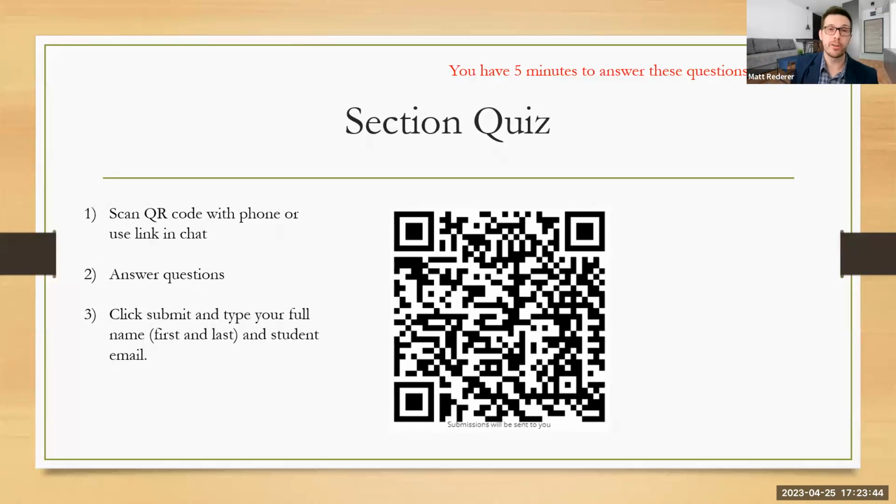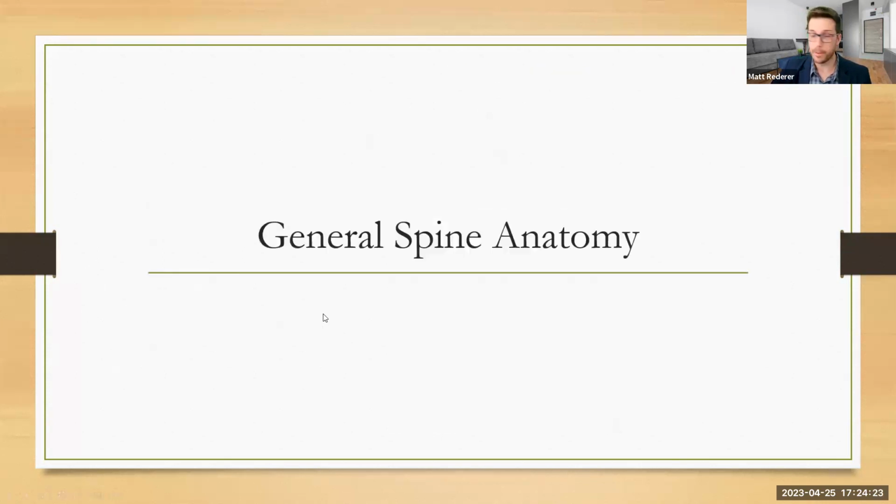Me just talking to them over an intercom doesn't help them. It's going to be just checking to make sure that they're not in panic, or if they need to be pulled out, and if they're physiologically okay. So I'm only communicating to give them a heads up. This next sequence is going to be 5 minutes. John Smith, are you doing okay in there? I'm not really going to be checking on his claustrophobia. If I do that, I'm going to go into the room, talk to him, and make sure he's okay that way. But I want to check the question and see if that's kind of where it's at or not. But you do need to talk to your patient regardless. All right, let's keep going here.